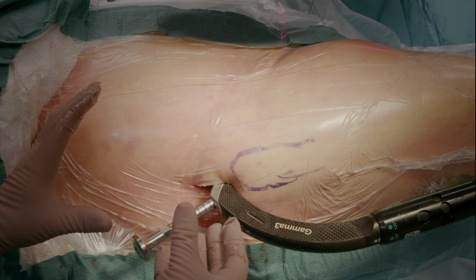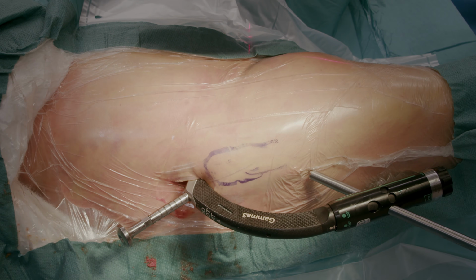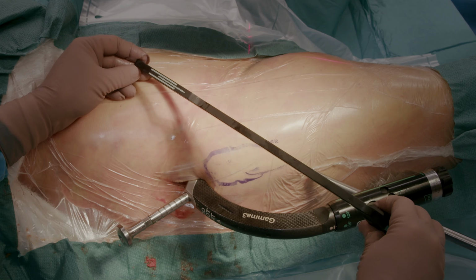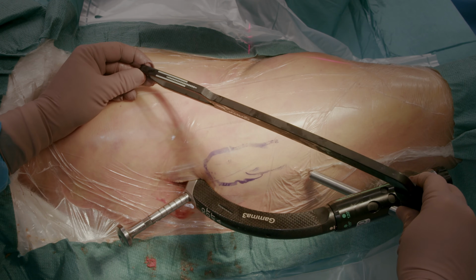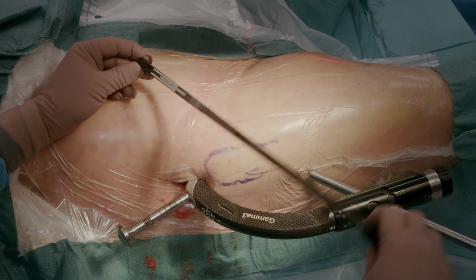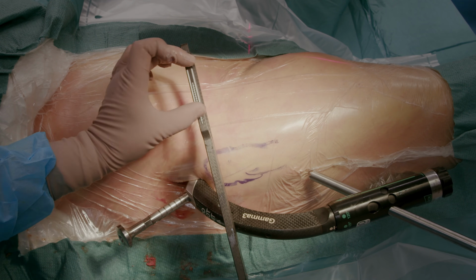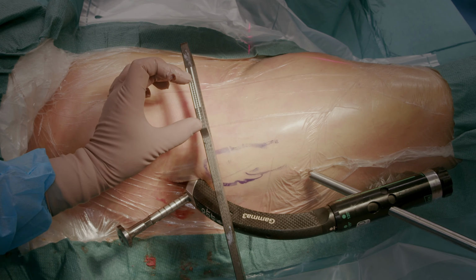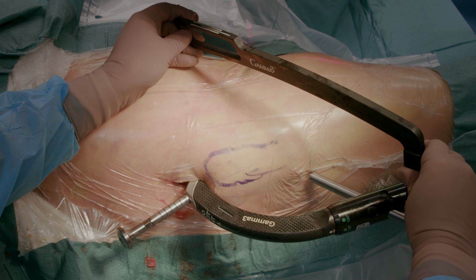It's now essential to check that the nail is at the correct depth and in the appropriate rotation. To determine the correct location for the lag screw in the femoral neck, we can use this targeting tool called the one-shot device, which is first connected to the guide sleeve of the lag screw. On this device, you can see these two solid lines and a string of beads between them. In the fluoroscopy image, when the string of beads is just between the two solid lines, it tells us that the C-arm view is completely perpendicular to the targeting tool.